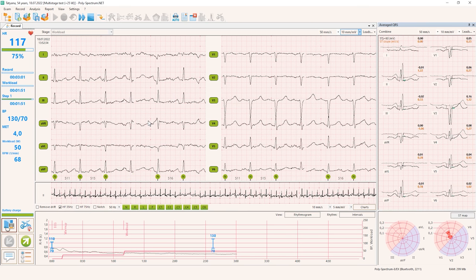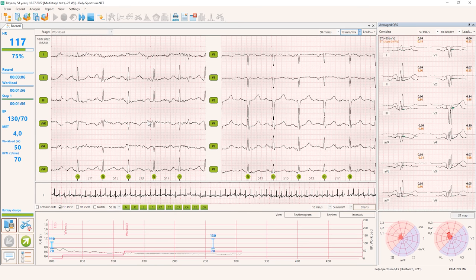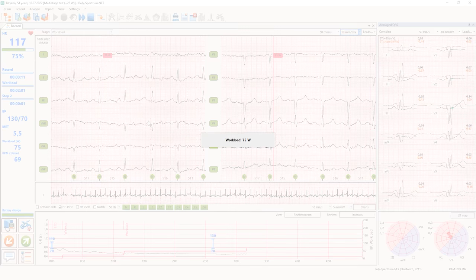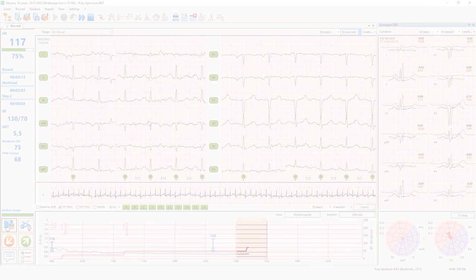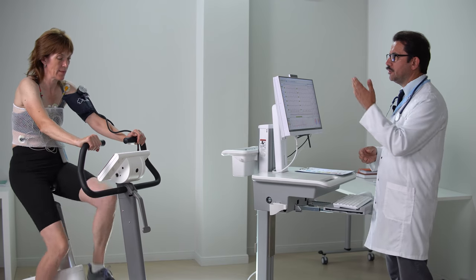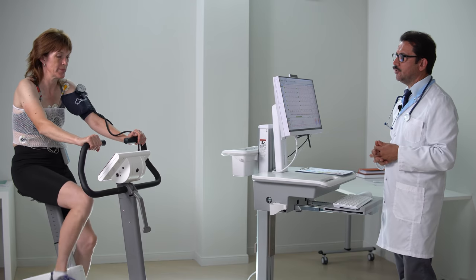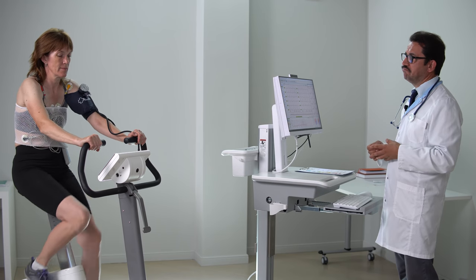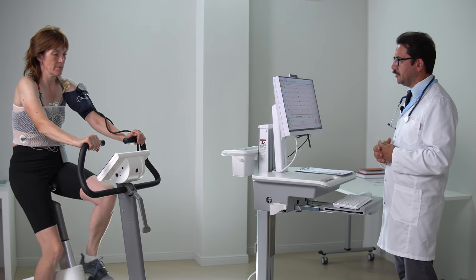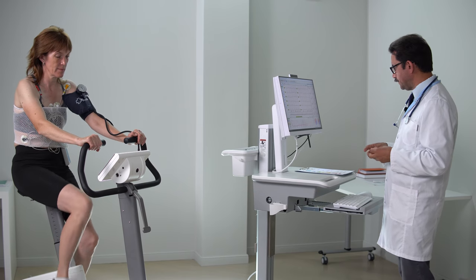So now we are close to switching to the next stage. Okay, next step. Maybe you should check the patient and encourage. Look in their eyes and check if the workload is appropriate, with no signs of fatigue or maybe some state when the patient may lose consciousness. Sometimes that happens.